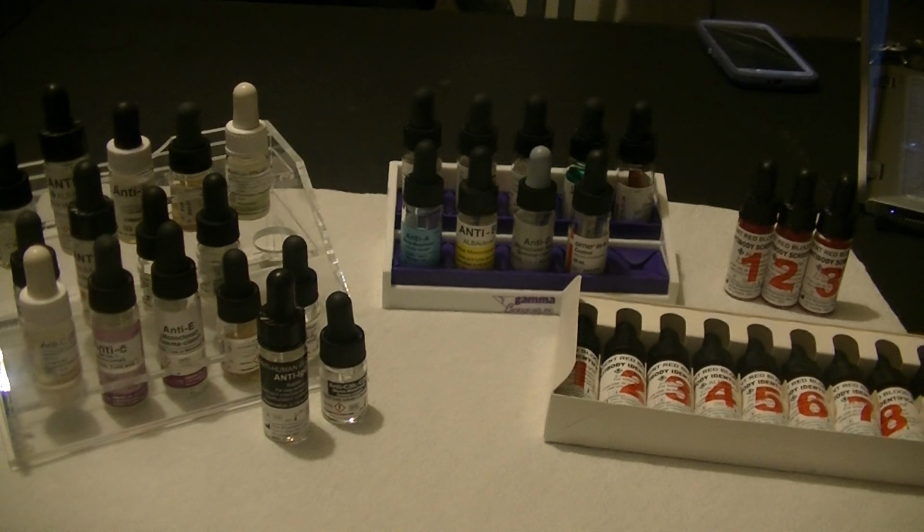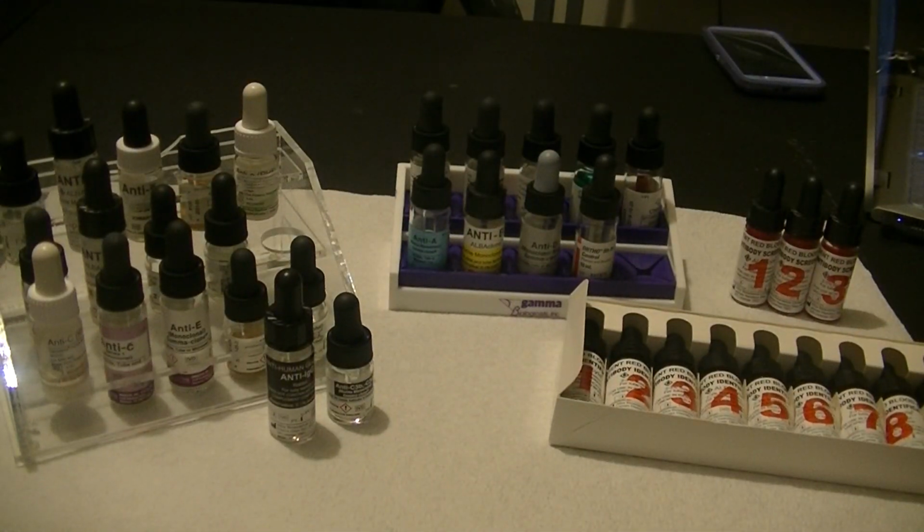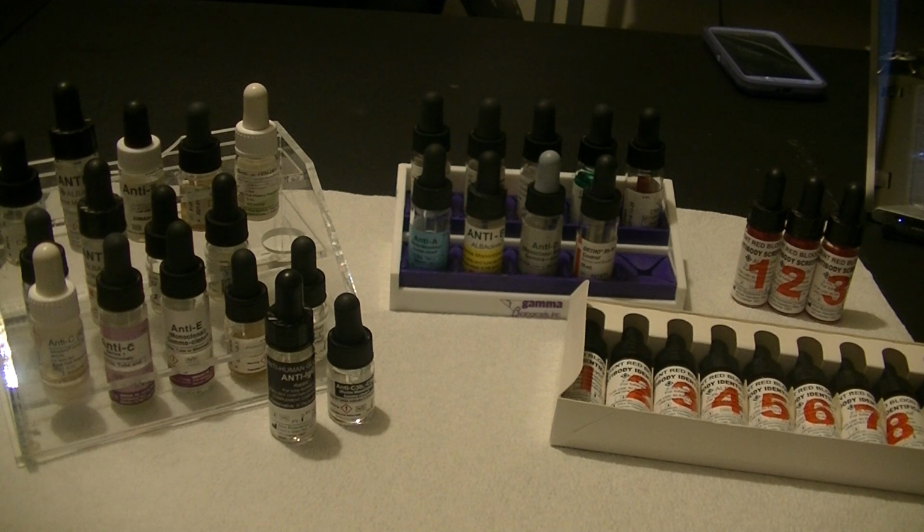As we go through the rest of this course, you will be watching videos that may or may not have been actually produced by myself, but those videos are going to use these different reagents in those different types of tests that will be performed in the blood bank.